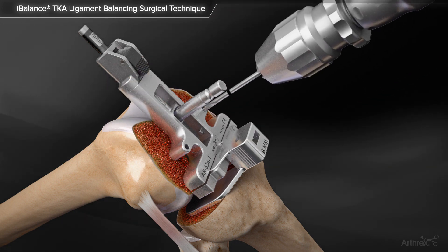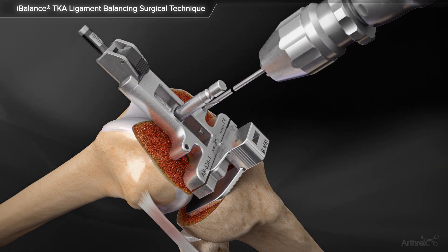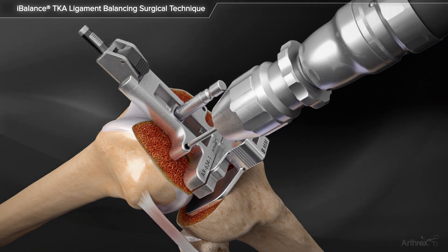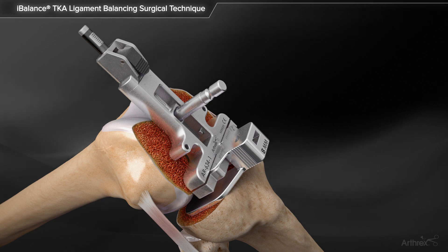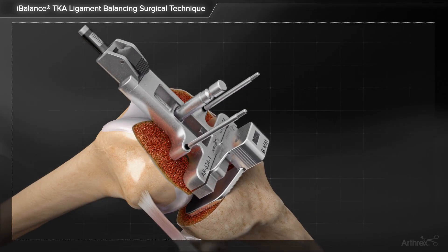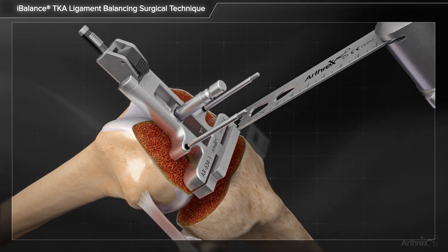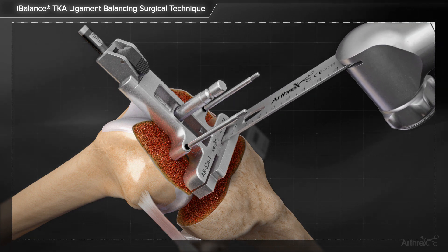Once the femoral component size is determined to be correct, the pinholes for the 4-in-1 block are prepared with the drill pin. Alternatively, the tensioner body can be pinned in place with two drill pins and the posterior femoral resection completed through the cutting slots on the tensioner body.